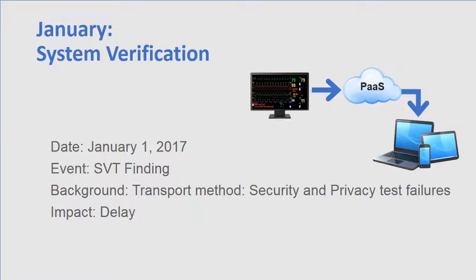Adding encryption and de-identification to the medical device software now will require non-trivial changes to the system's requirements, risk control, and verification test documents, not to mention its software design documents and unit test suite. All of this must be followed by re-verification. Project rollout comes to a standstill while the development team studies how to retrofit an encryption and de-identification approach into its cloud interface. This is not simple or quick.